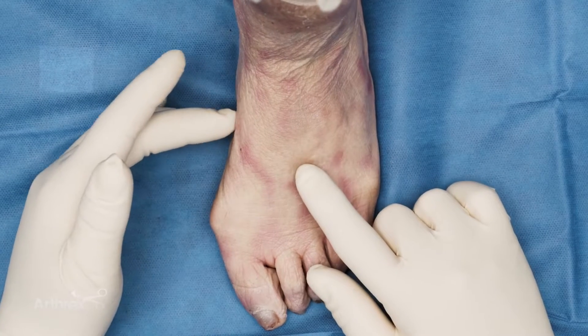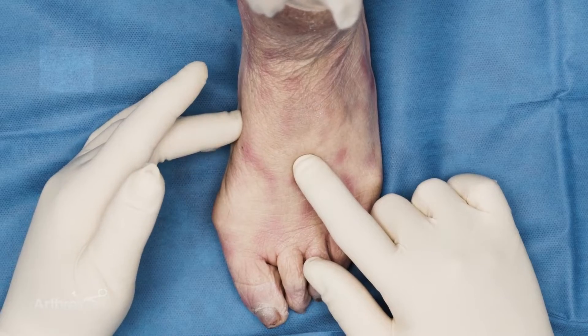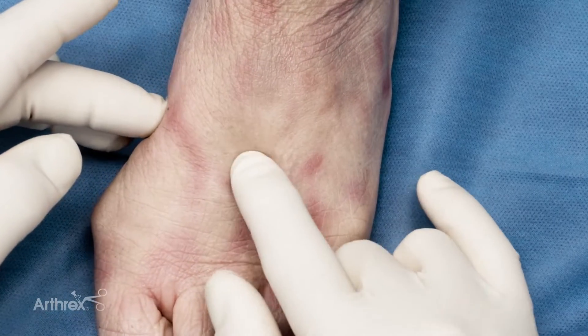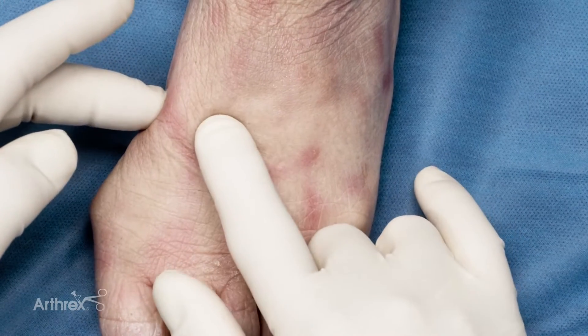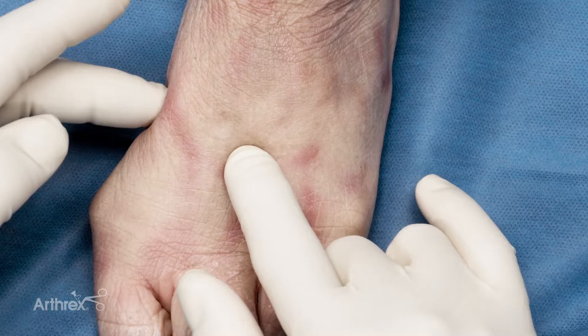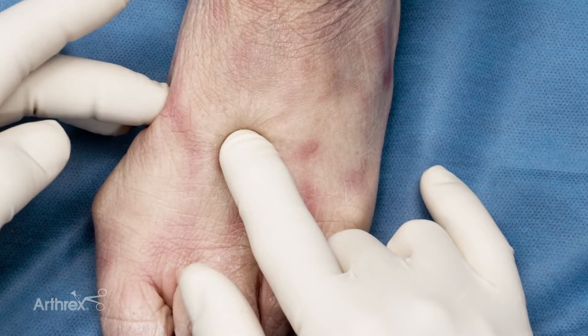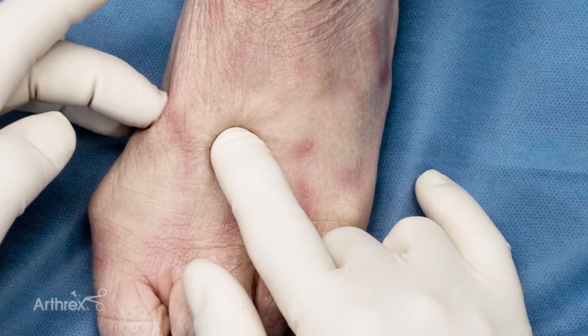Hi, this is Carl Haas. I'm going to talk to you about a mini tightrope technique for a Lisfranc injury. We have a disruption of the second tarsal metatarsal joint and we need to reduce it. Why not use a suture button device that will actually allow for some sagittal motion and some forgiveness if you're off a little bit, versus a screw that once you put it across, you're locked in that position.